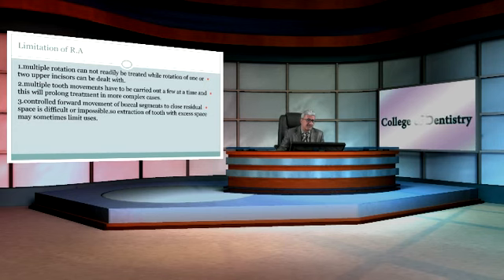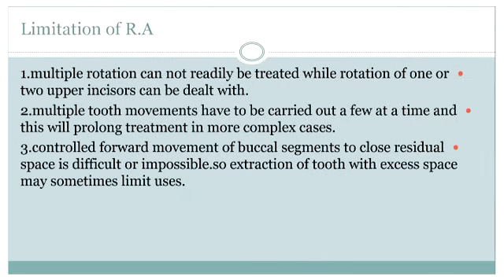Limitations. We have a very important limitation. Multiple rotations cannot readily be treated, while rotation of one or two teeth can be dealt with. Multiple tooth movements have to be carried out a few at a time, and this will prolong treatment in more complex cases.